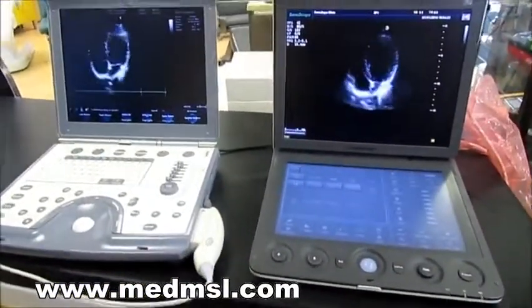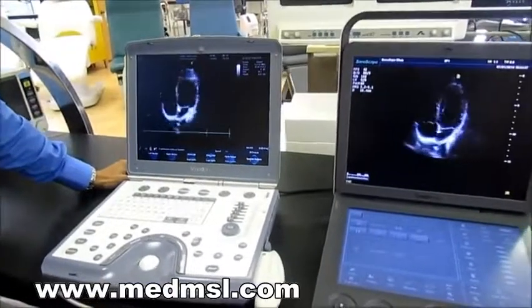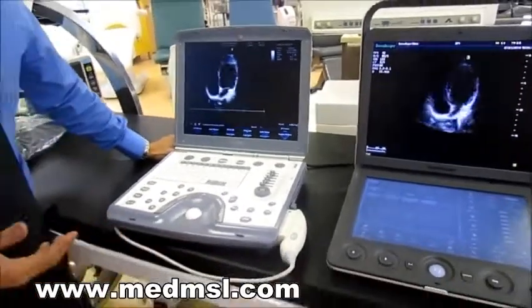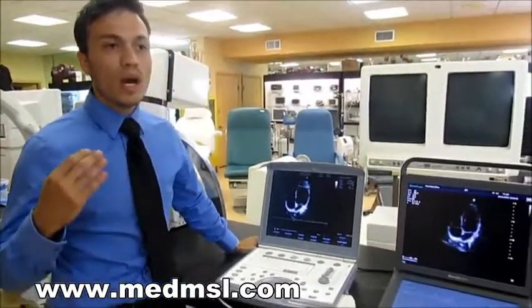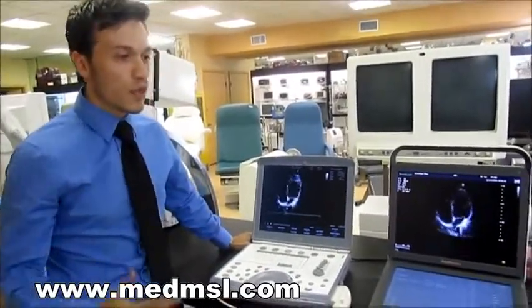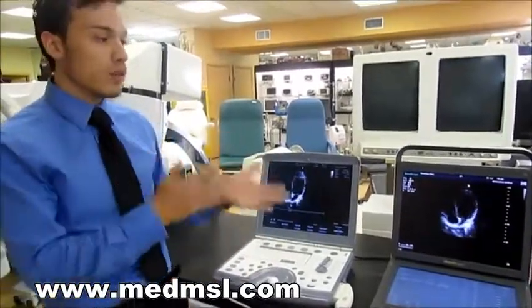With the Vivid Eye or pretty much any other GE system, you're going to have to buy additional software. If you want to do vascular, you'll have to purchase that vascular package. If you want to do cardiology, you'll have to purchase that license. And if you want to do obstetrics and gynecology, that's something else you have to pay for.